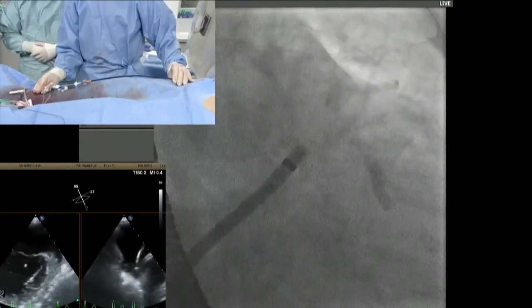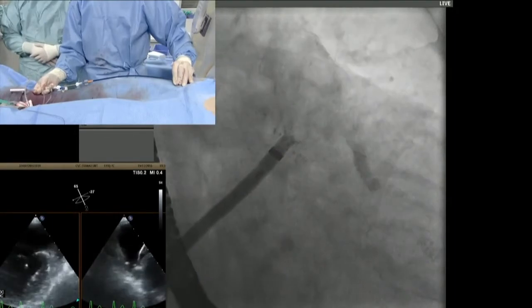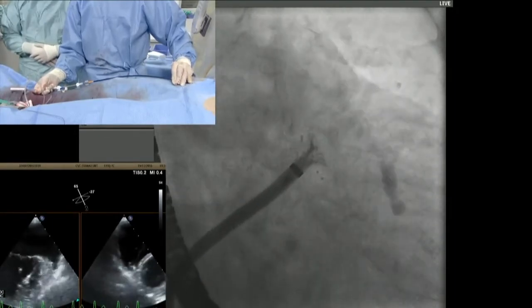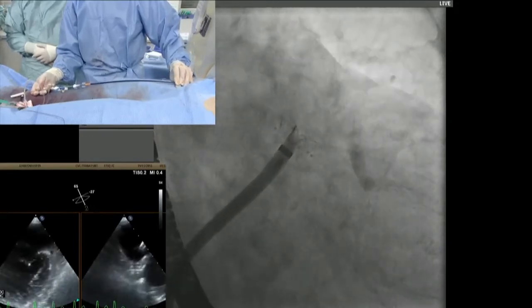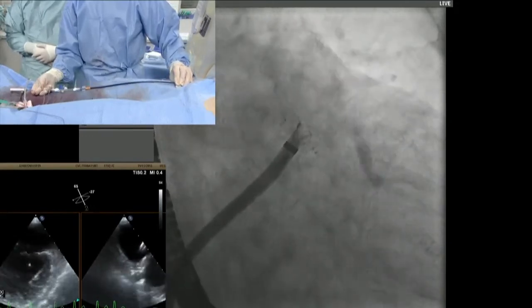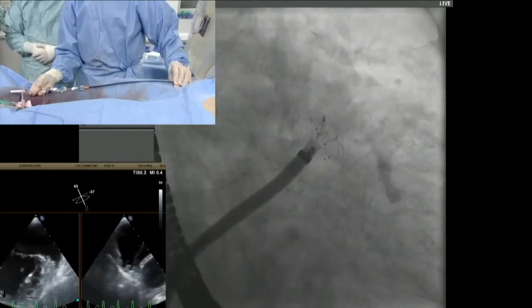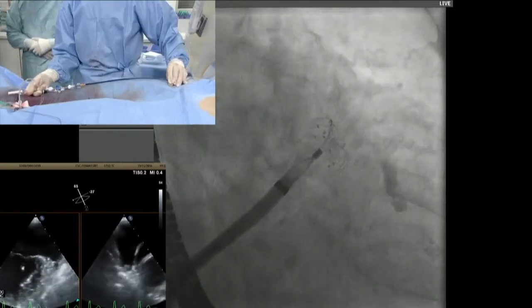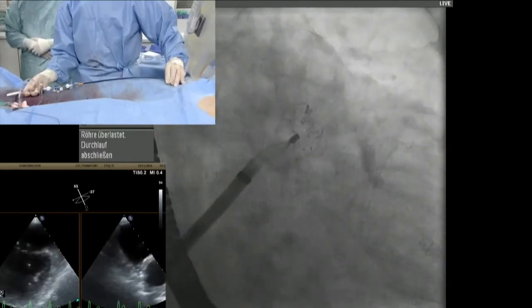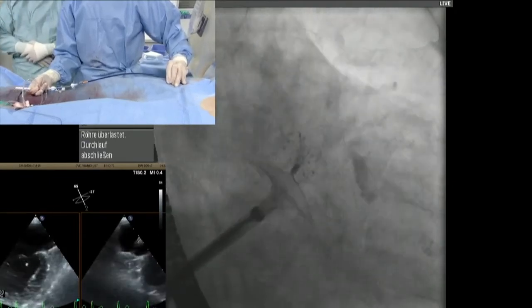Yes, go ahead. Yeah, keep pushing. I'm rotating counterclockwise. We will explain in a second. Yeah, that's better. No, that's nice. I think you were not happy about the umbrella not fully opening, is that correct? Yes. Previously. Now it's very nice. Now it's fully opened.